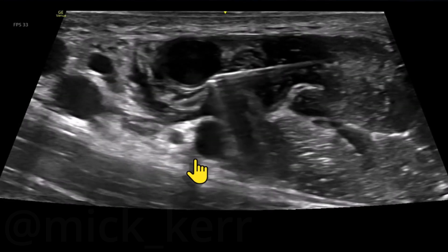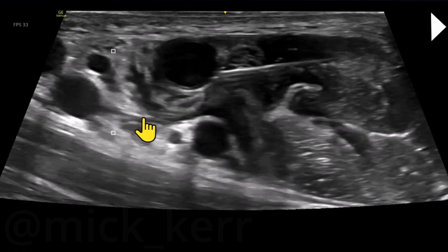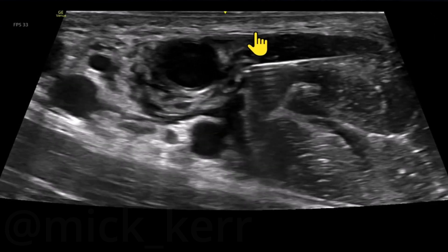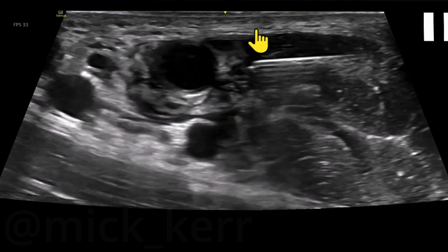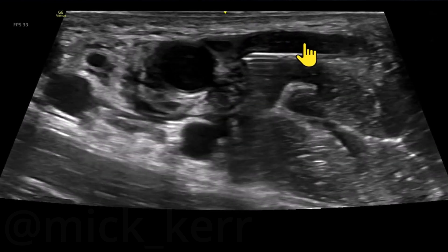So a reasonable spread, but I haven't got great views of the ulnar or radial nerve. The median nerve is here. I've injected as I've withdrawn — you can see the faint sort of donut of local around it, but it's really not great. I would like to improve that if I could, but in a safe way.